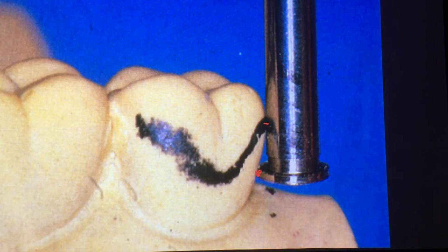Only the terminal third. So if I draw this, which you're going to do today, most likely, the clasp stays on or above the height of contour and then dips down below the height of contour and engages the undercut right here that I'm demarcating in red. This here is very passive, this part of the clasp. It doesn't engage, only the terminal end.